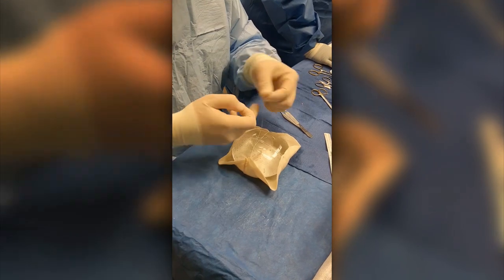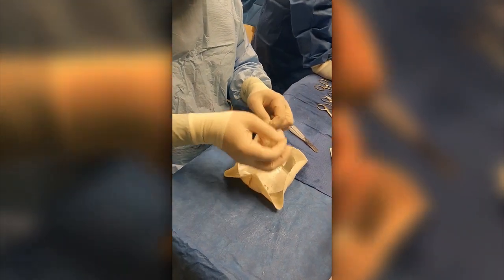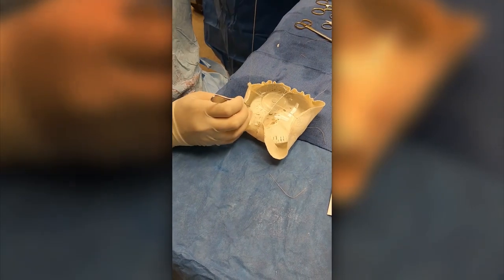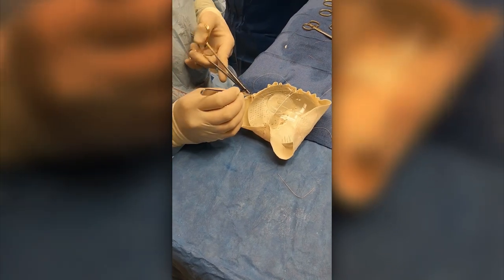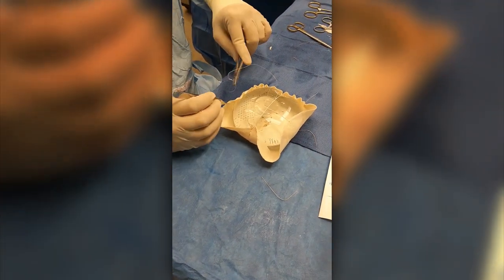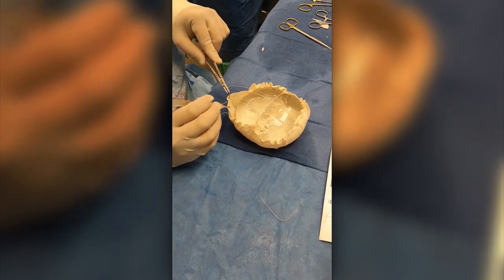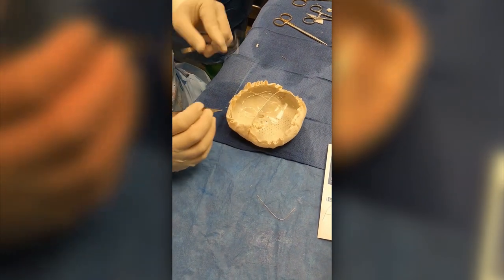Stacy is here just to get this in place and then we're going to purse string it next. Just cruising around this purse string suture — I throw kind of one direction and then come out the other way. Here we are rounding out the whole circle; I'm going to come through here with the last couple of these purse string stitches.